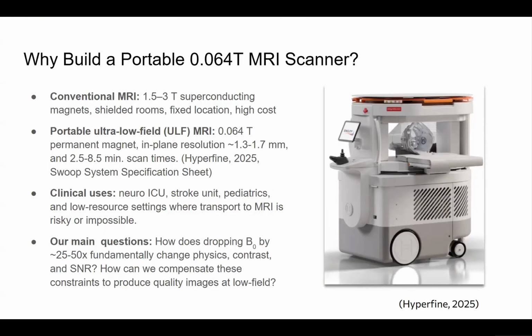Together, these aims let us understand portable MRI not as a worse 3T, but as an imaging modality that lives in a different physical regime with its own constraints and opportunities.